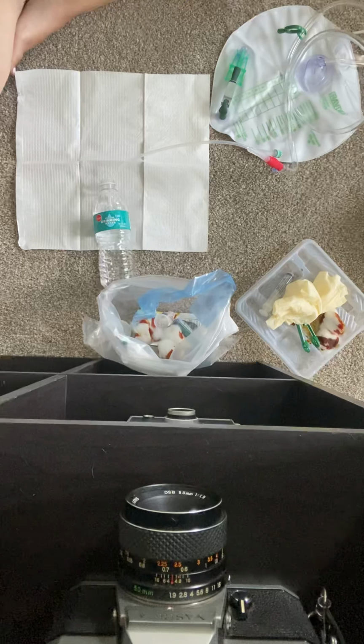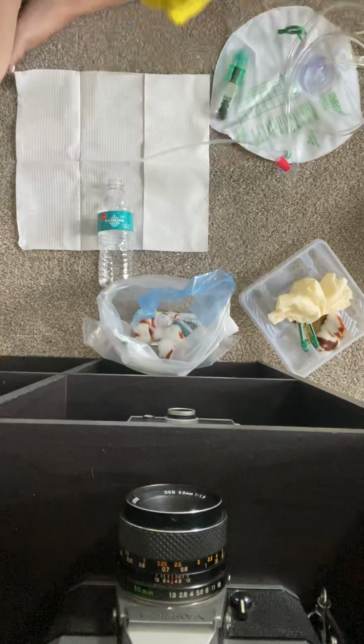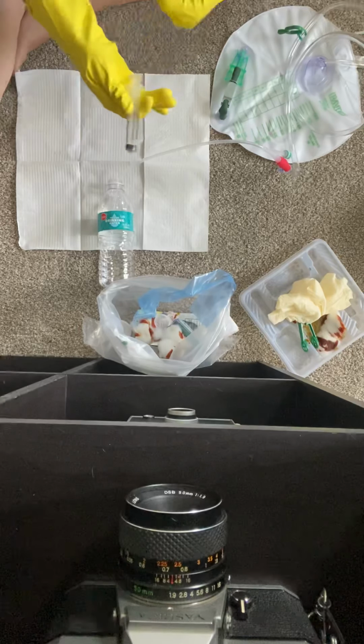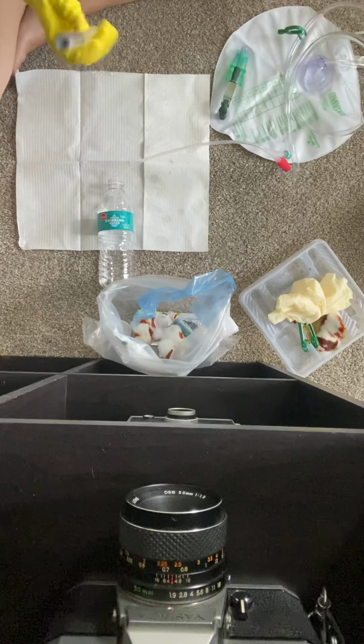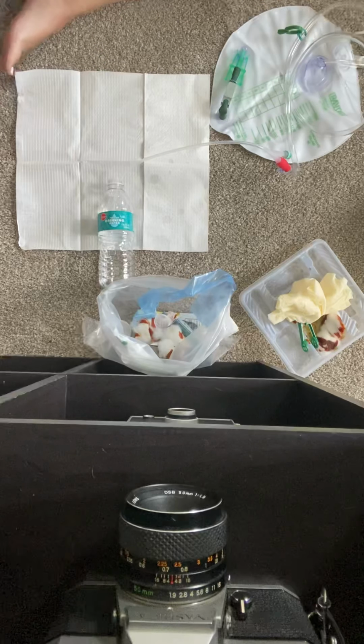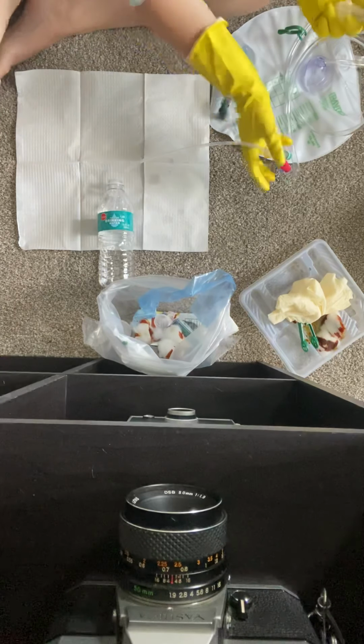So let's say I have a normal saline syringe. I would take it out of the package, push that saline out, and then I would have an empty syringe.